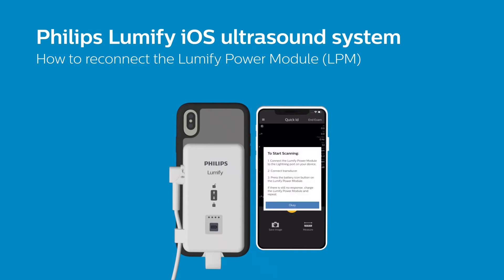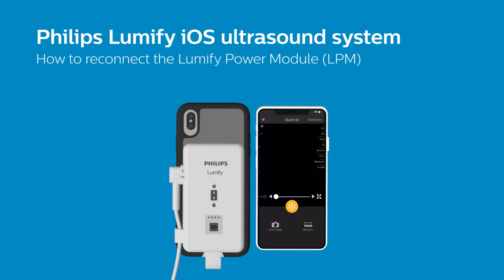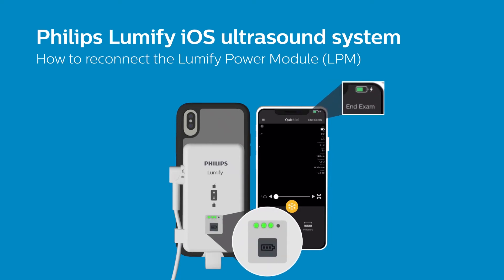To reconnect, first make sure that you are using either the rigid connector or flexible cable included with your purchase to attach the LPM to the lightning port of your iOS device. Then press the battery icon button on your LPM to initiate the reconnection process.